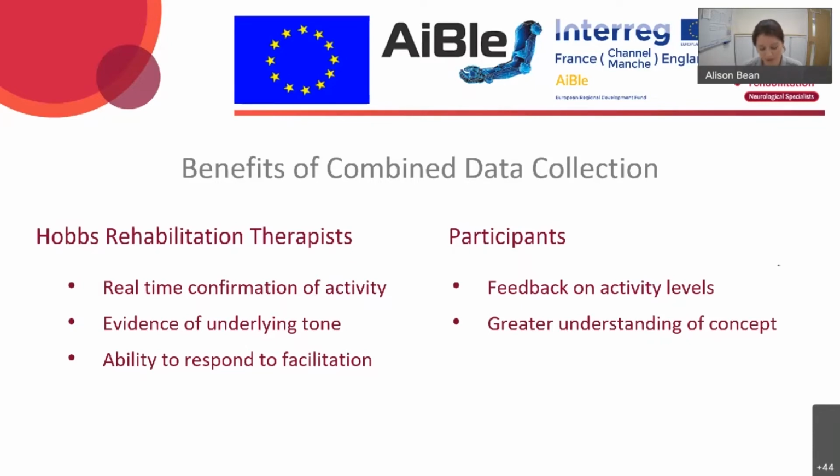But there's a point in that first video where I asked the patient to breathe, and this encouraged her to stop and relax, and you can see the EMG trace reducing before she then continues the movement. And this allowed us to see as therapists that her increased tone had settled before she commenced the next movement. For some patients, facilitation, whether that be physical handling or verbal prompting, can increase activity levels. And immediate EMG feedback such as this, we could also use it as a comparison to see whether these treatment strategies were appropriate for those individuals.